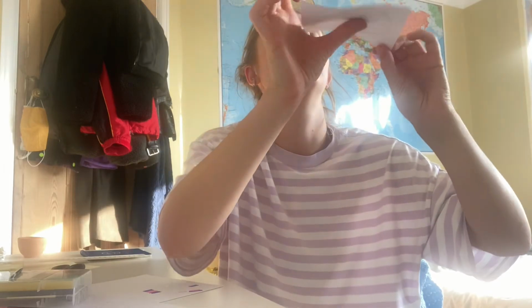I can't really remember how long the first one took, but I might leave it overnight just because I did put a lot of PVA on it to seal it. And then obviously if we leave it overnight, it's less likely to have any damages. I think I might leave it over this pot here, because you see how the edges of mine curled up. I'm going to leave it on top of here to try and avoid that happening as it dries, but we'll see. It's never going to be perfect, but it's one of those things you can just put in a book and then it will sort itself out. So yeah, I'm going to let that dry and I'll come back when it's time to colour it.